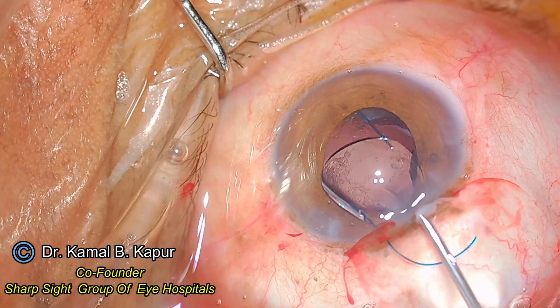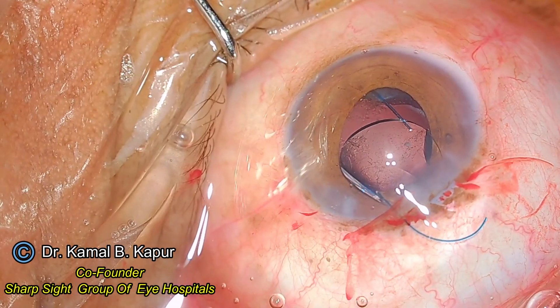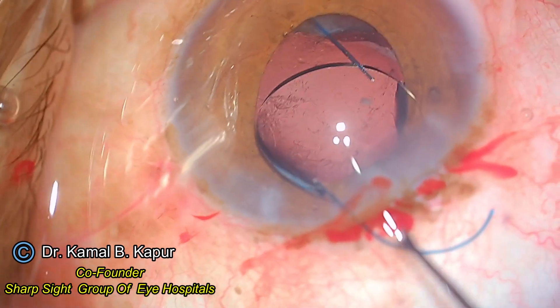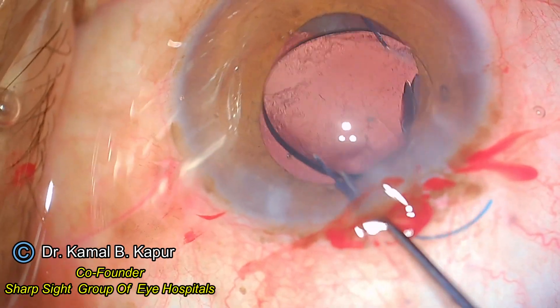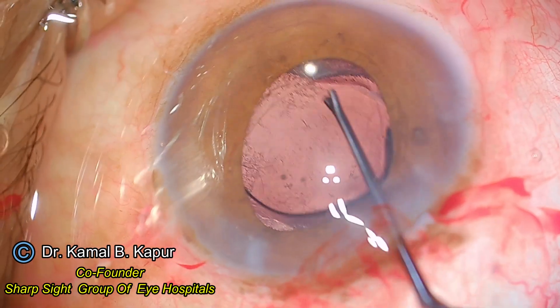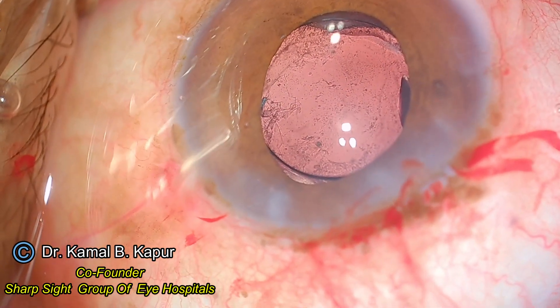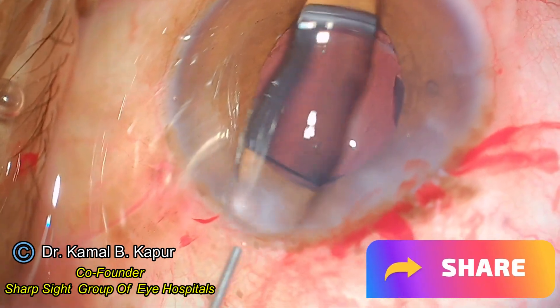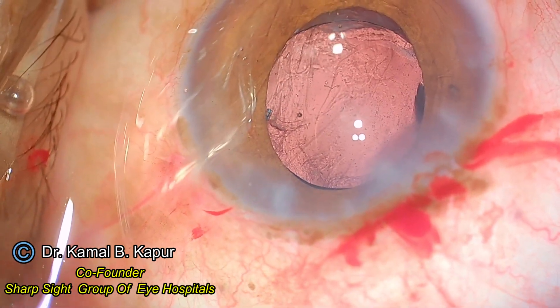As the haptic is opening up, my cartridge straightens and the IOL opens nicely and smoothly. I hope the endothelium is protected throughout. Once the IOL has opened up, all you need to do is dial it with a blunt instrument or use a Sinskey hook to dial it into place.